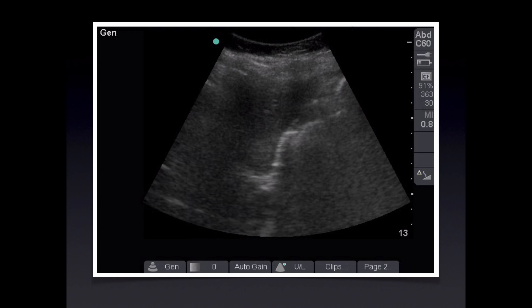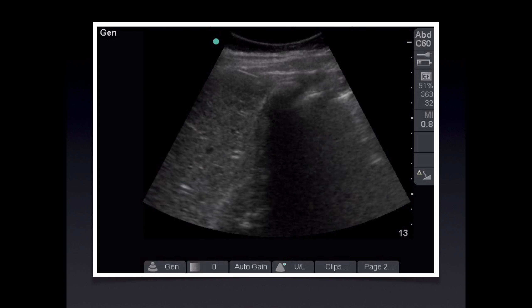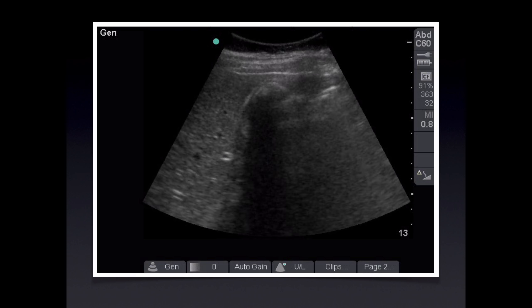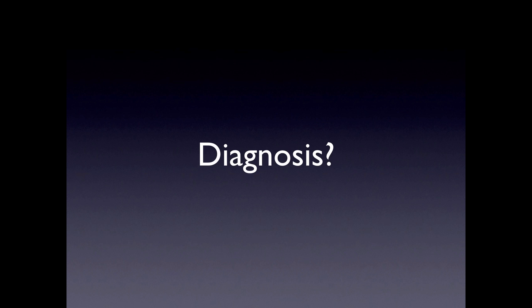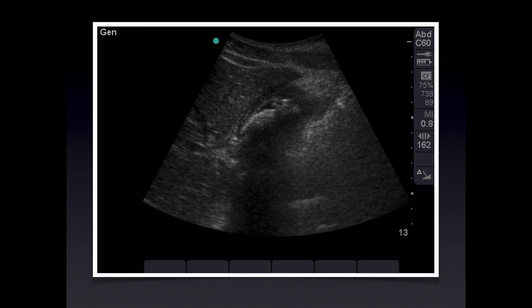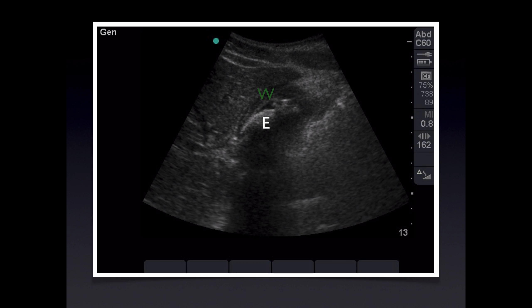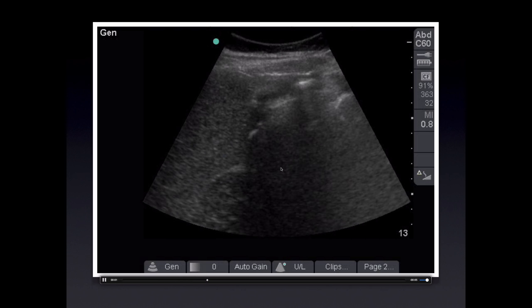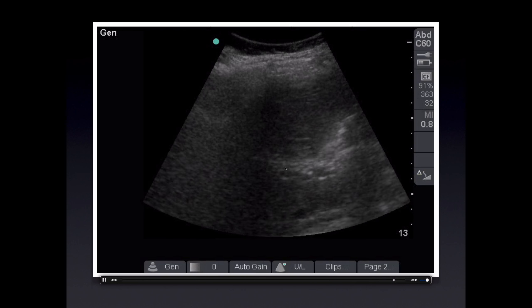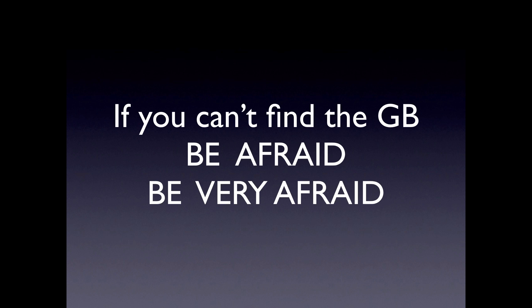Case 4: gallbladder sweep — this is a tough one. Here's the corresponding still: this is the feared and ominous wall-echo-shadow, or WES sign. We see the liver clearly, and up against the liver edge as expected is the gallbladder anterior wall. Then we see a bright white echo casting a dark shadow — this is a large gallstone. Reviewing the pathology in live-action, we see the portal vein clearly, and not seeing the gallbladder at that point is very concerning, especially when you realize there's a large shadow obscuring it. The moral: if you can't see the gallbladder, be afraid.